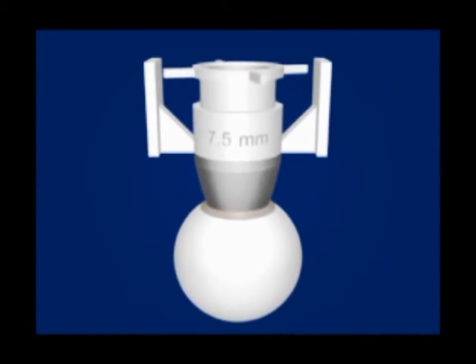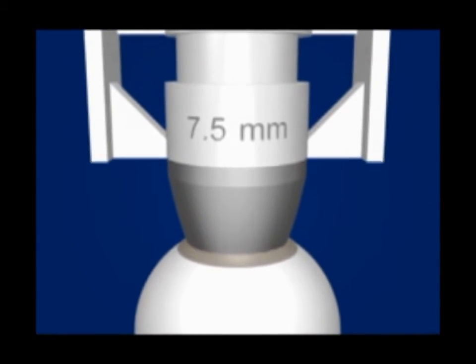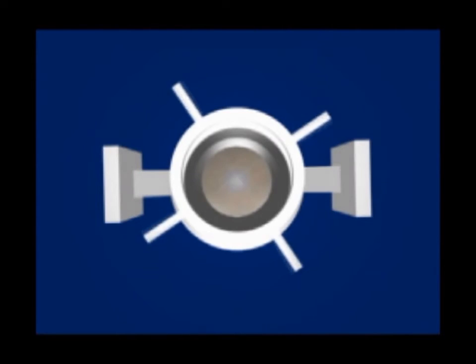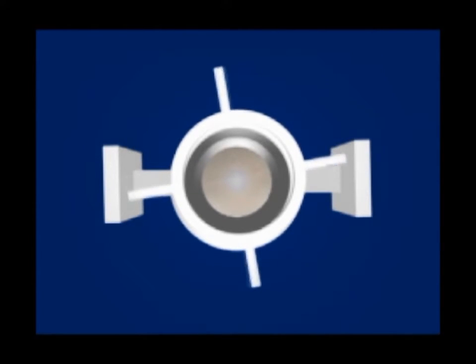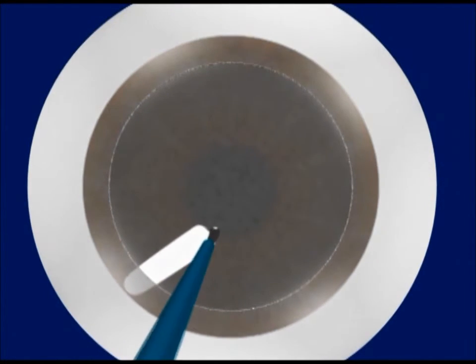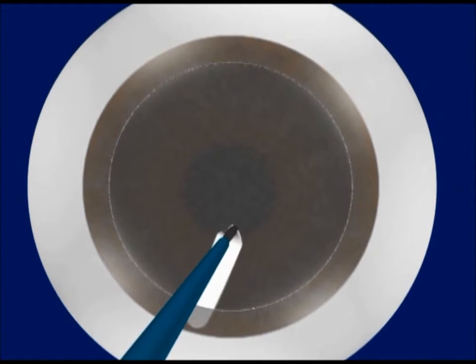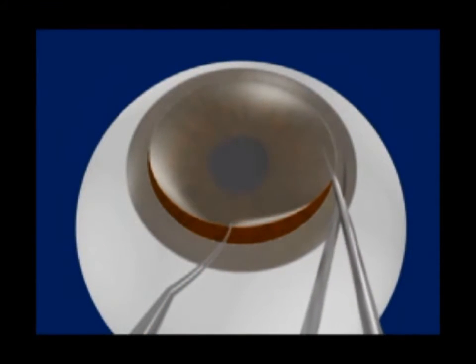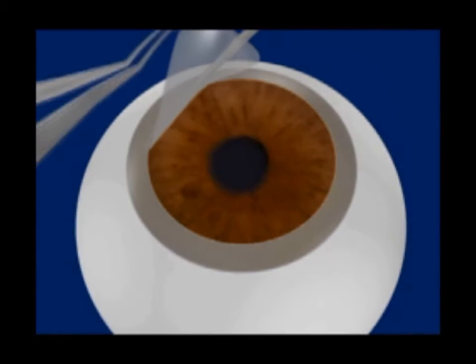Now we proceed to the creation of the complementary host surface. A partial-thickness trephination of seven point five millimeter diameter is done in the host, up to a depth of 300 microns. A lamellar pocket is created up to the limbus all around with the crescent blade. The anterior chamber is then entered and the host is cut full thickness and removed.